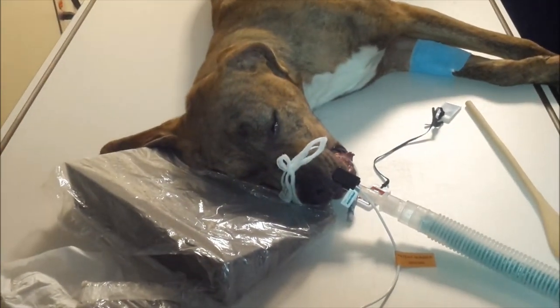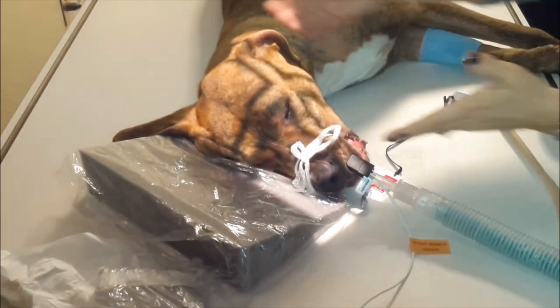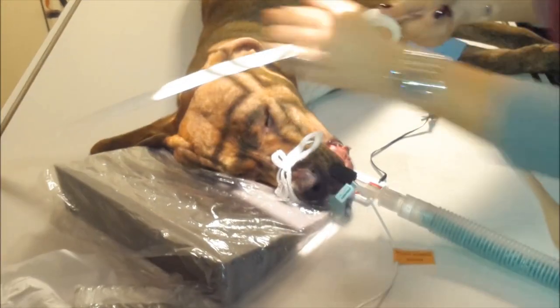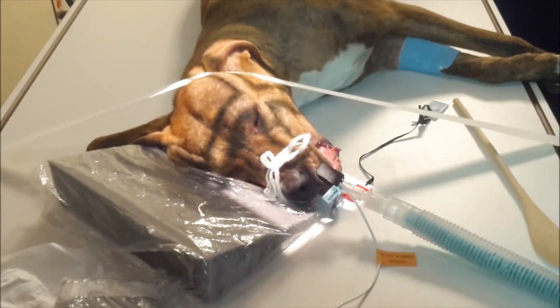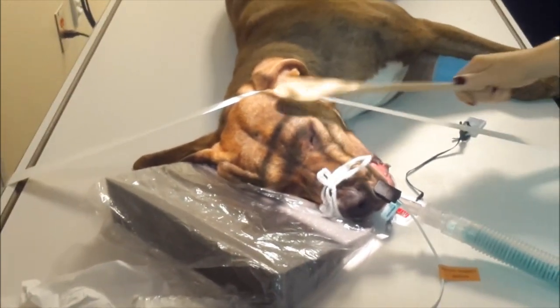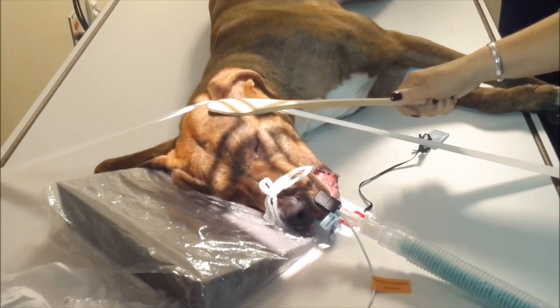If your animal is not fully sedated, you can't do manual restraint on the head, even with gloves, because the entire head is in the primary beam. To combat that, you can place tape across the head to help if they're still able to lift their head. You can also use a wooden spoon from farther away, placed either on the muzzle or on the actual big part of the skull — remembering to be wearing lead if you're going to be in the room.